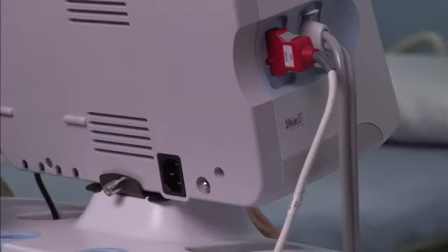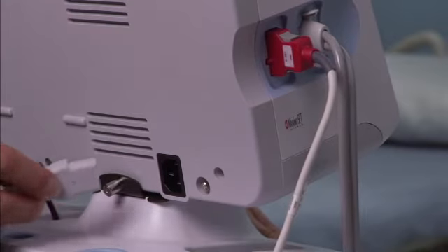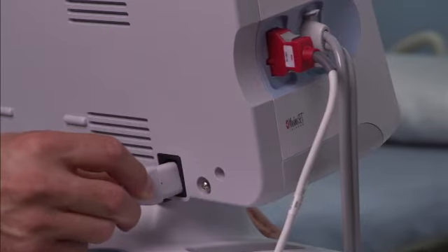New batteries are only 30% charged, so be sure to connect the device to AC power immediately after inserting a new battery.